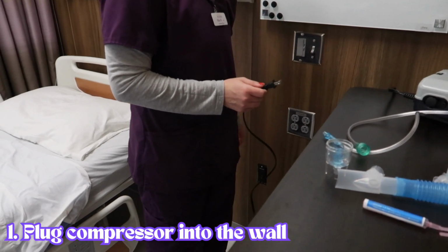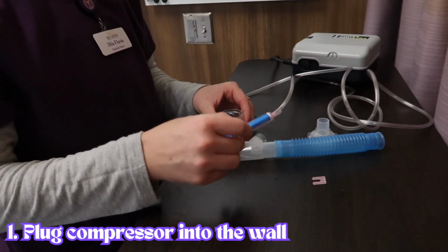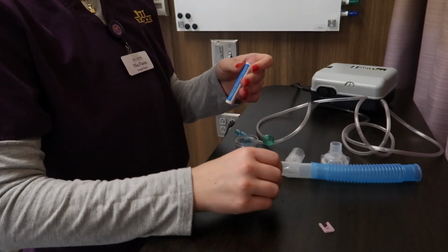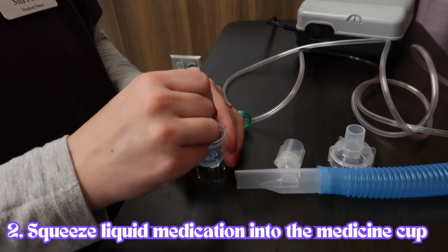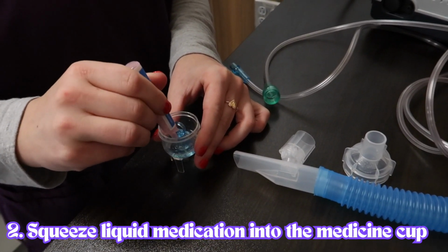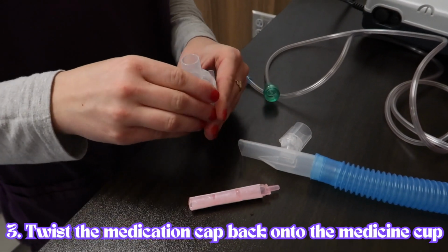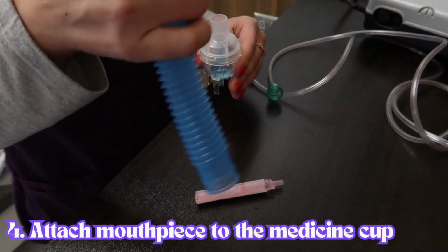I'm first going to plug the compressor into the wall. Now I'm going to prepare the medication inside the medication cup, which is done by twisting off the top of the medication ampule and squeezing it in around the centerpiece. Then I'm going to screw the lid onto the cup. I'm going to then attach the mouthpiece.